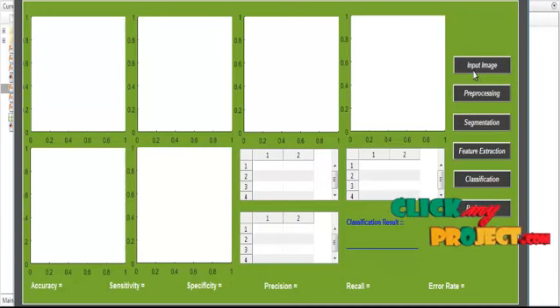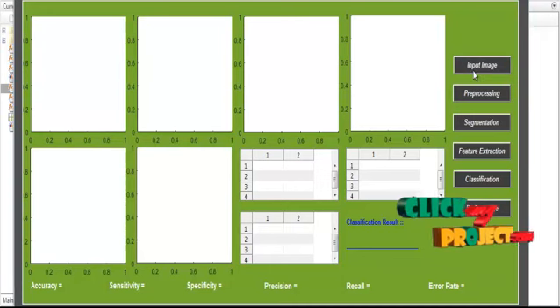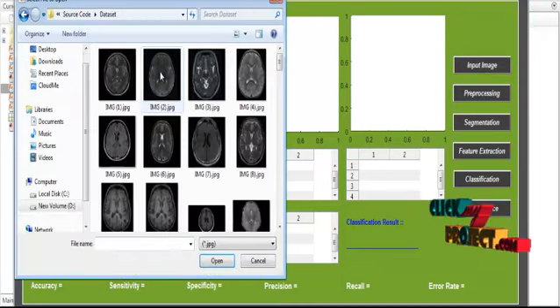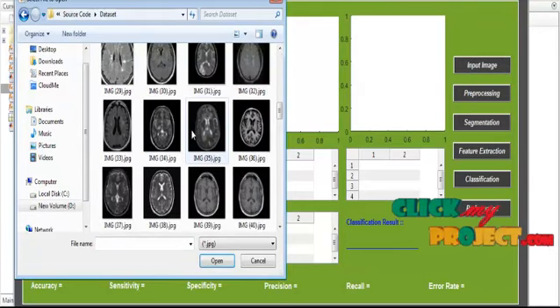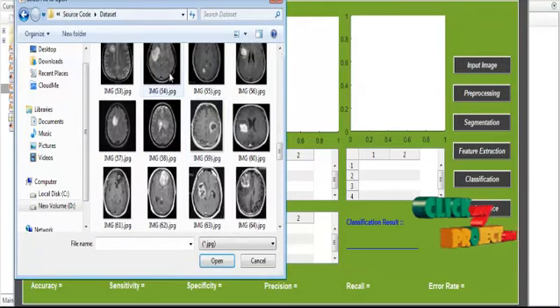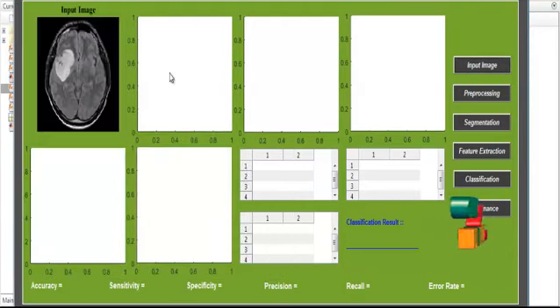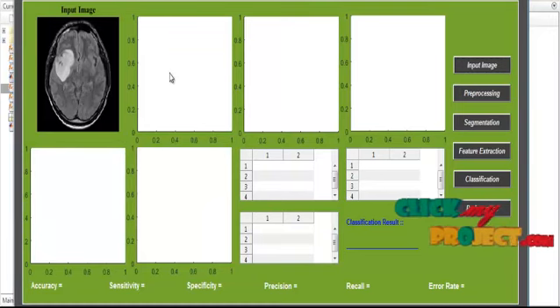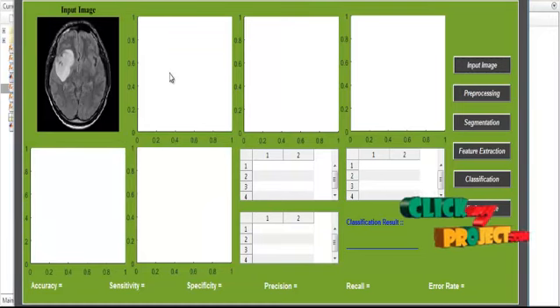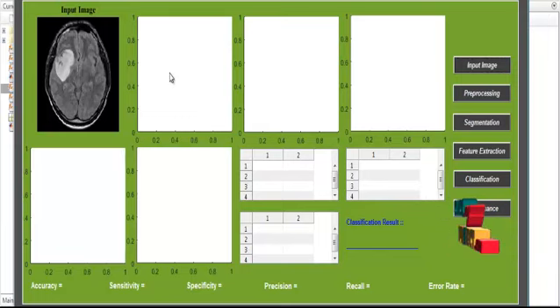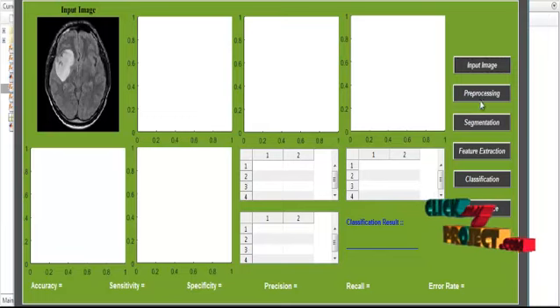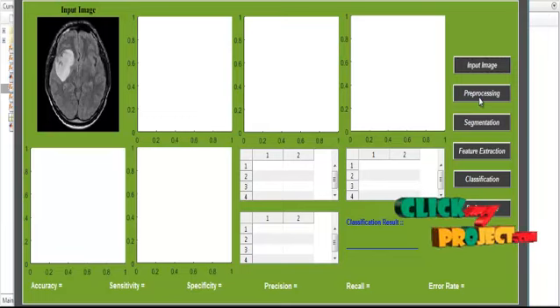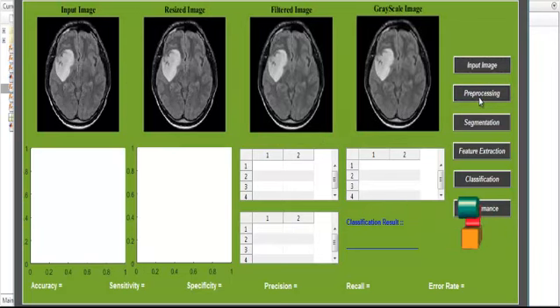First of all, click the button Input Image. After clicking the Input Image button, open the dataset folder and select any one image from the dataset. After selecting the image from the dataset, the corresponding image is shown in axis 1 with the title of Input Image. After getting the input image, we move to the second stage of the project, which is preprocessing.